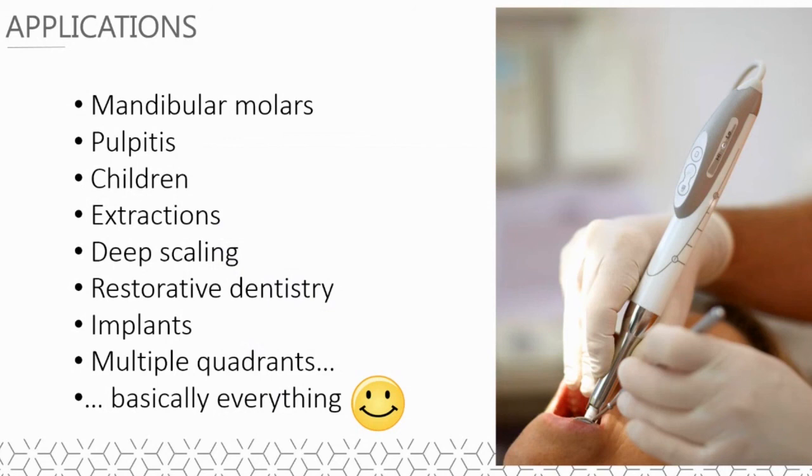You now understand that the applications of the technique are extremely versatile, and intraosseous anesthesia will have a positive effect for almost every treatment. In the current situation, from a practice management perspective, the efficiency associated with the immediate effect and productivity achieved by optimizing long appointments with multiple quadrant treatments make intraosseous anesthesia with QuickSleeper a major asset towards increasing time efficiency and productivity.